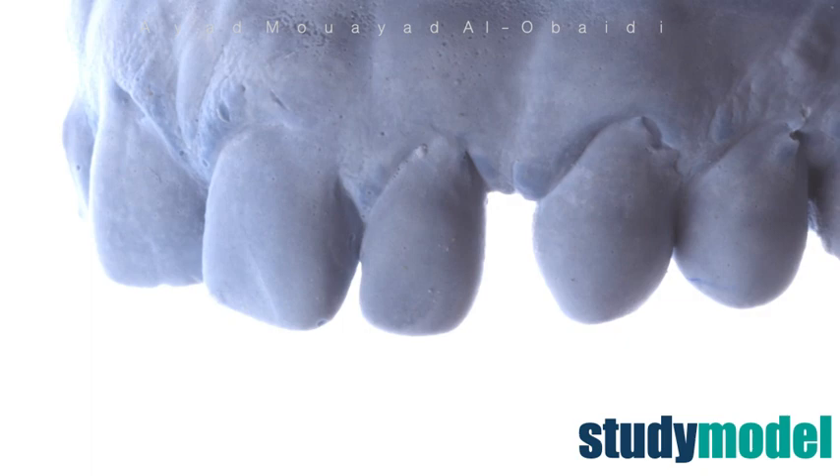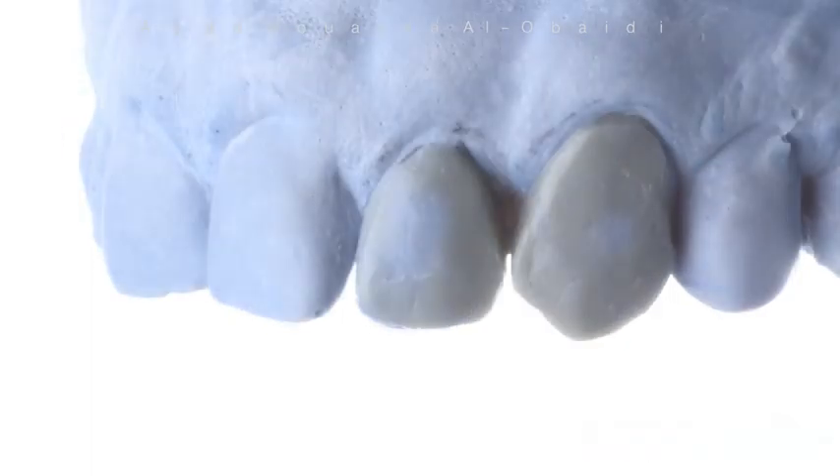First of all, we should take a study model. A wax up was made on the model to create the silicon key. The wax up is extremely important, not only to show the patient a possible final result, but also to guide us during the layering process.